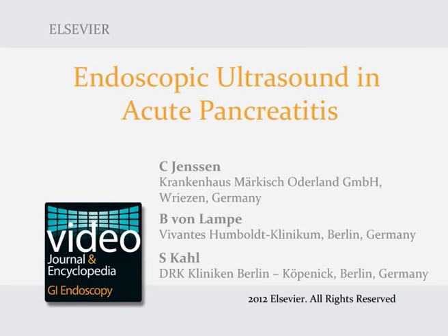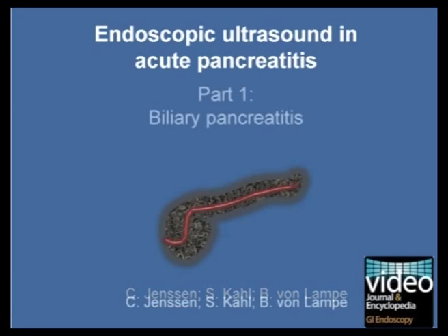Part 1 of the video demonstration describes the crucial role of endoscopic ultrasound in biliary pancreatitis.